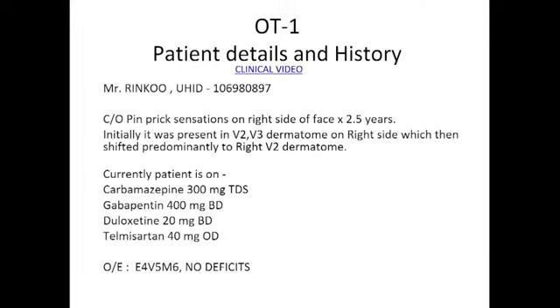So now a little bit of it. And you will take it to 75 degrees. Now we'll give RF of 75. No, this is high. Okay, and for 60 seconds you can switch it on.